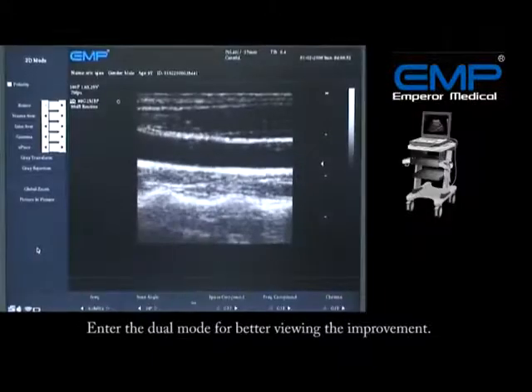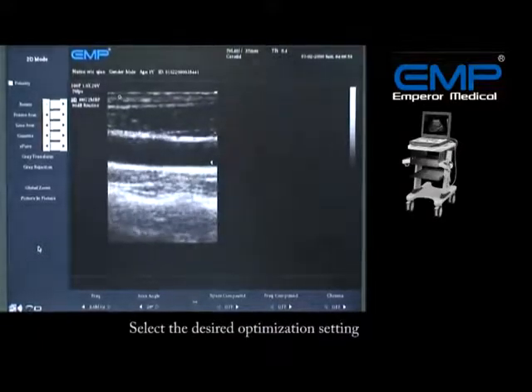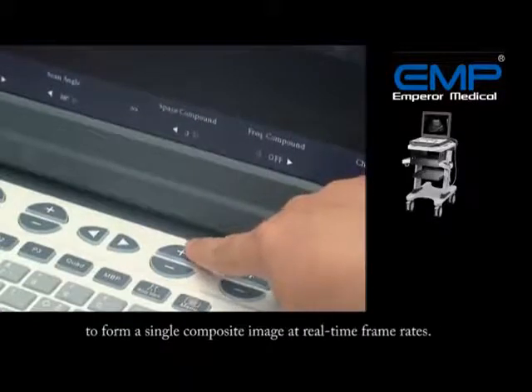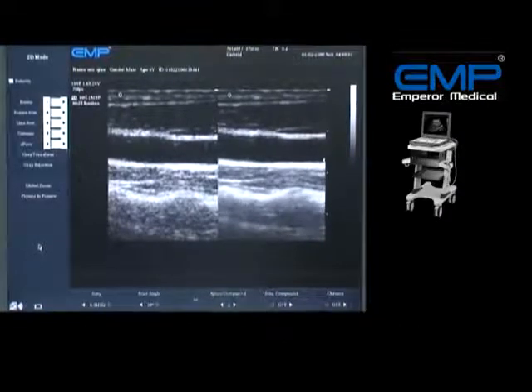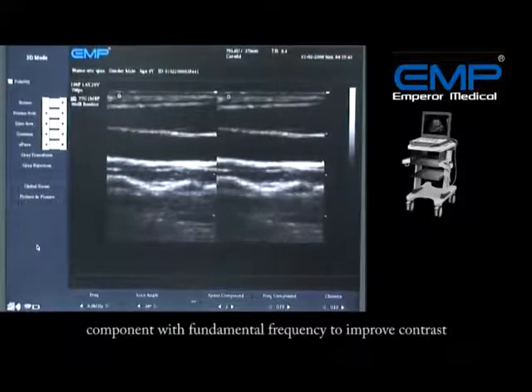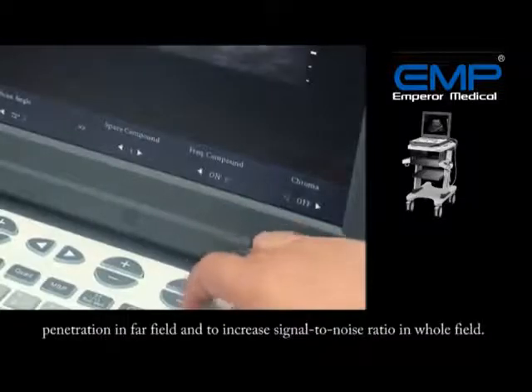Enter the dual mode for better viewing of the improvement. Select the desired optimization setting from the screen menu by pressing the soft key. Space Compound Imaging combines multiple lines of sight to form a single composite image at real-time frame rates. Frequency Compound Imaging integrates the harmonic component with fundamental frequency to improve contrast resolution in near-to-middle field.